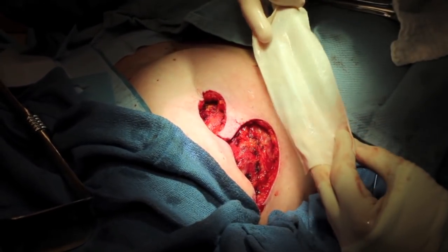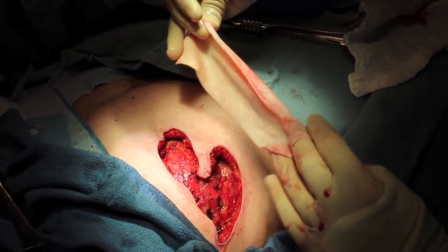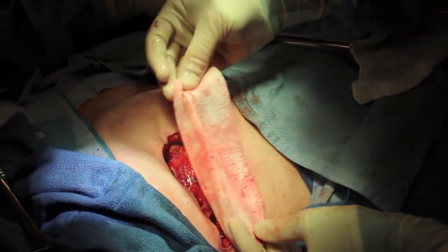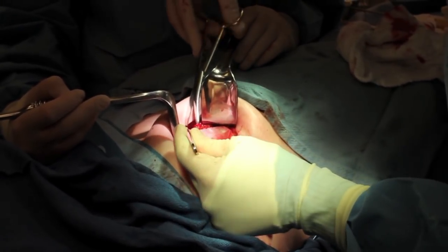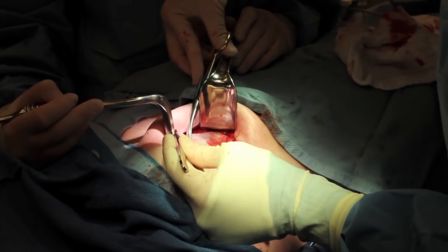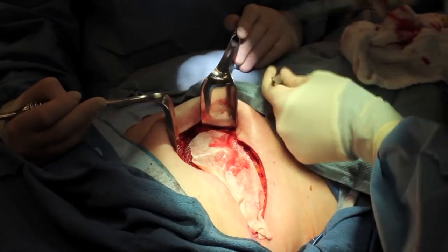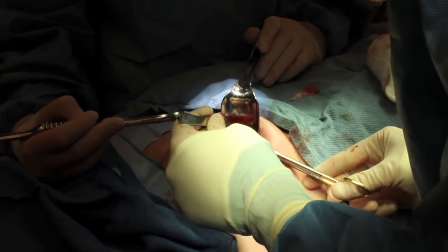This is Alloderm, a cadaveric dermis, and we identify it by placing some blood on the dermal side, which allows us to orient it. Here we place it into the body and we trim it to fit in order to form a sling from the pectoralis major muscle to the inframammary fold, which serves to hold the tissue expander.